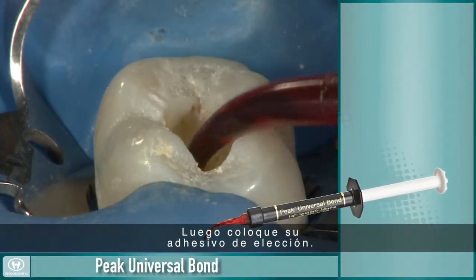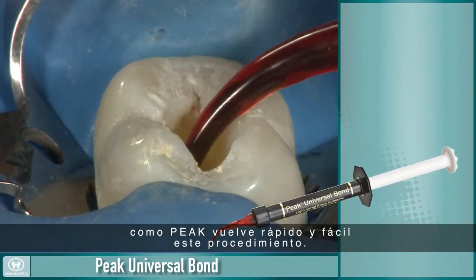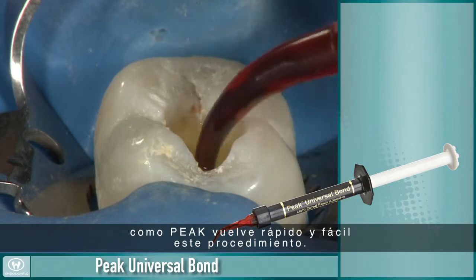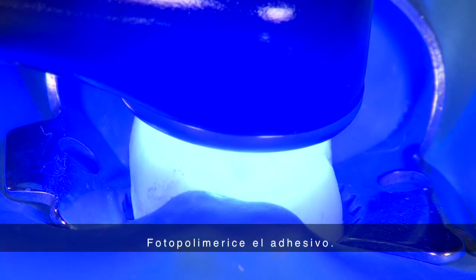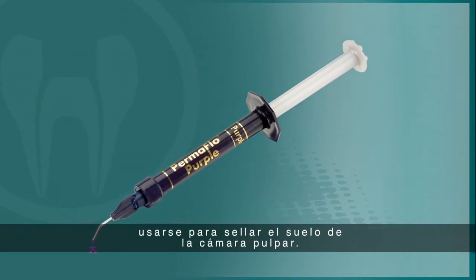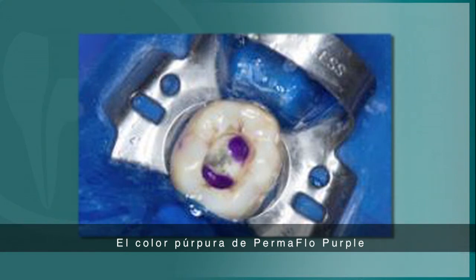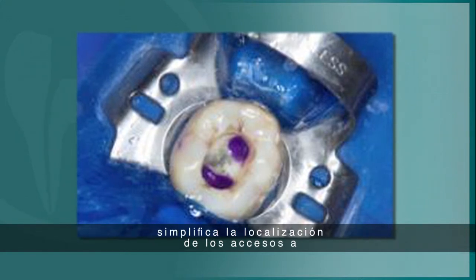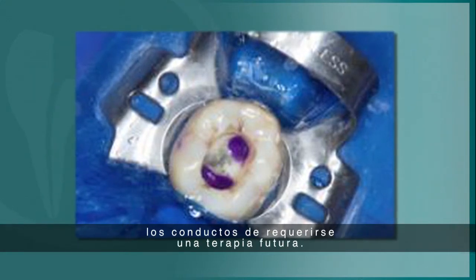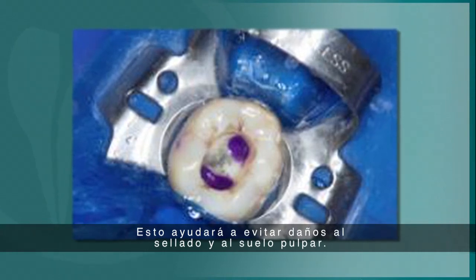Then, place your bonding agent of choice. A syringe-delivered bonding system such as PEAK makes this procedure quick and easy. Light cure the adhesive. Permaflo Purple or another flowable resin should be used to seal the floor of the pulp chamber. The purple color of Permaflo Purple simplifies locating the canal access should future therapy be needed. This will help to prevent damage to the seal and pulpal floor.